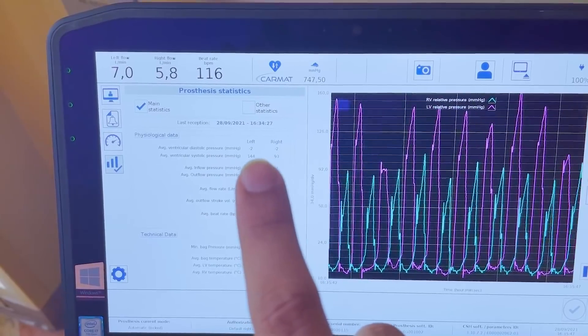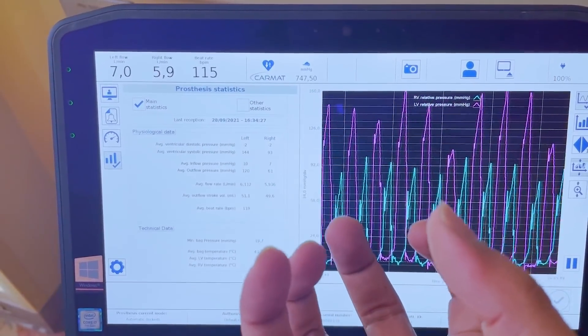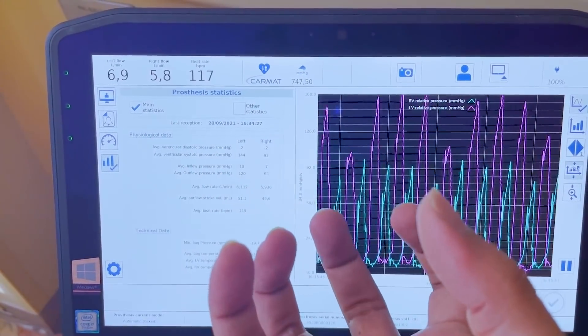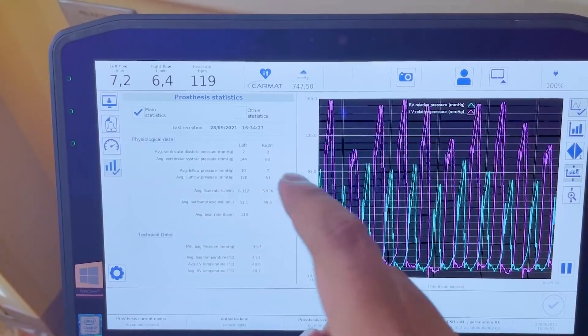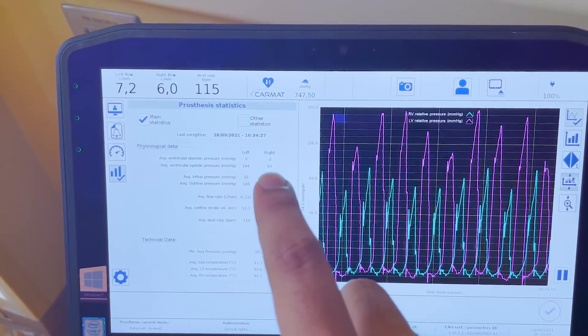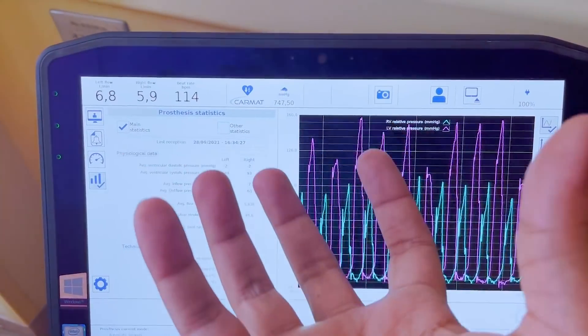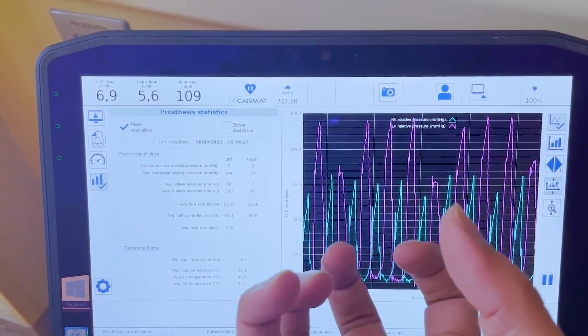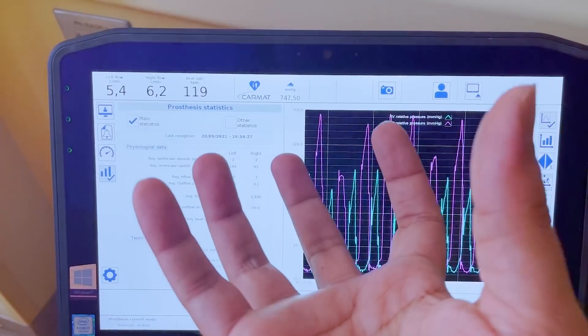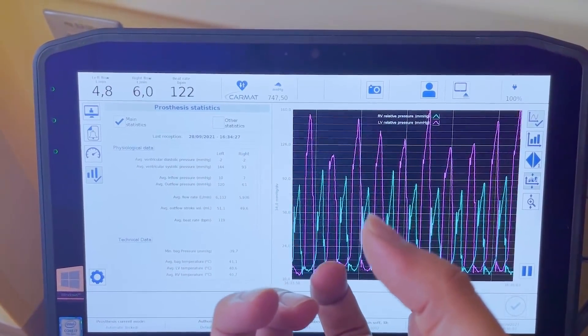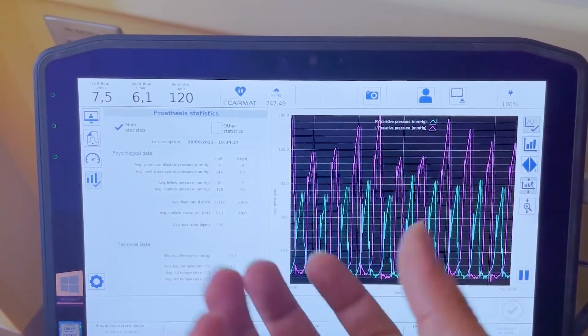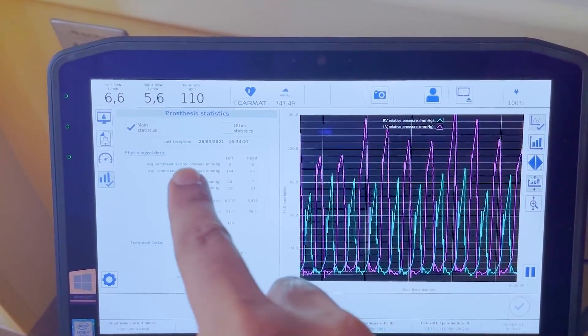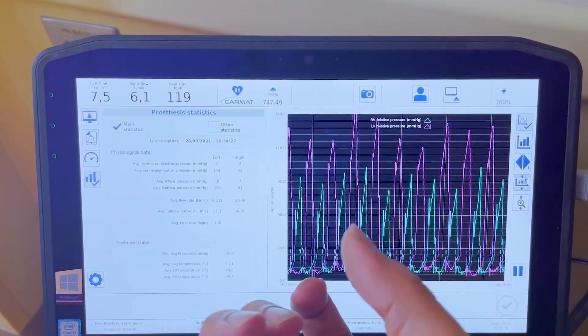The diastolic pressures are negative, so you want the diastolic pressures to be negative so the heart can really suck in, and then systolic pressure on the left side LV, right side RV. So you want diastolic pressures to be lower, close to zero, so it really sucks in, and then the systolic pressure to be high so it gives a good output. Diastolic pressures are good, so it's sucking in good.